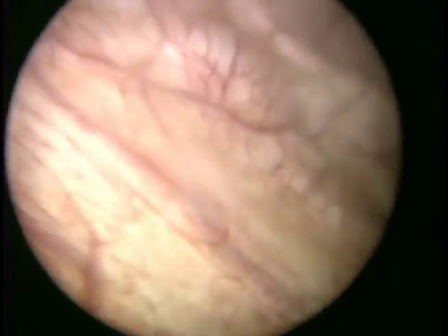Time should be taken to inspect the bladder walls and identify the location of both ureteral orifices. Here we can visualize the right ureteral orifice, which is quite close to the edge of the prostatic rim.